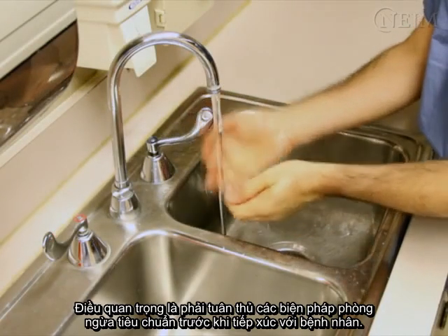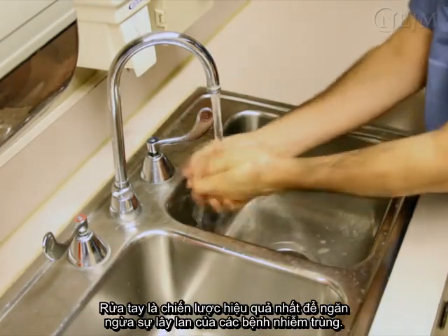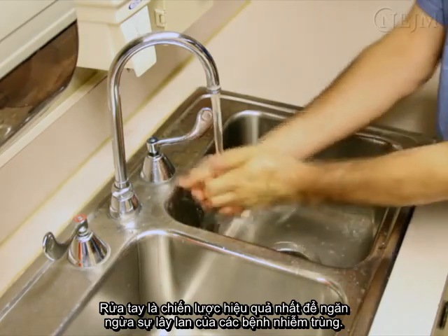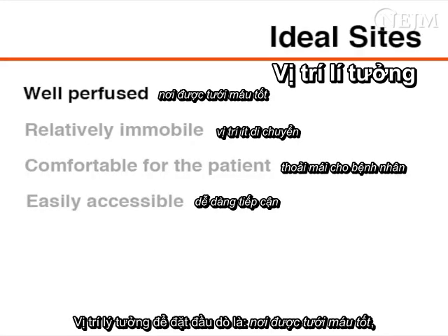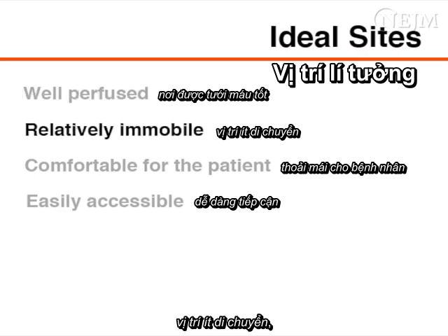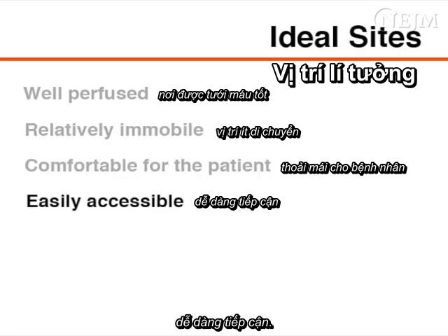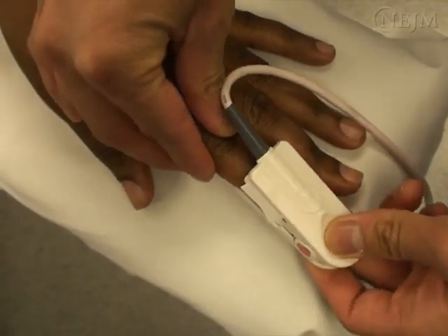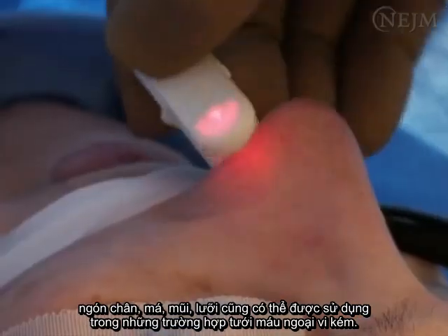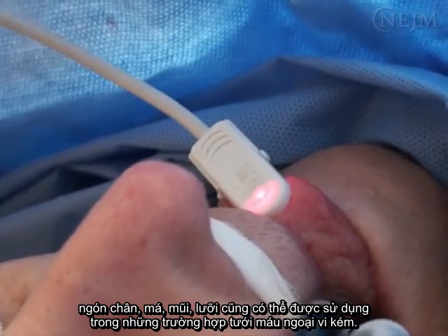It is important to adhere to standard precautions before any contact with patients. Hand washing is the single most effective strategy to prevent the spread of infections. The ideal site for placement of the pulse oximeter probe is one that is well perfused, relatively immobile, comfortable for the patient, and easily accessible. The earlobes and the fingers are commonly used sites.